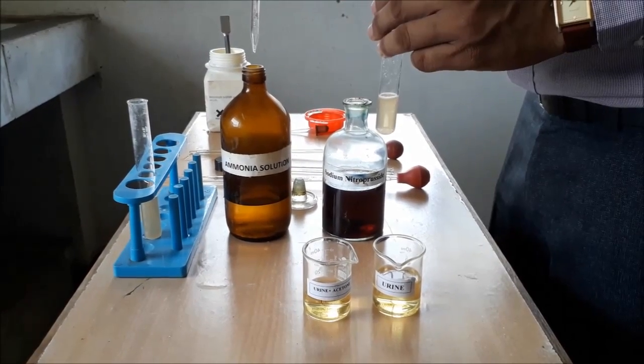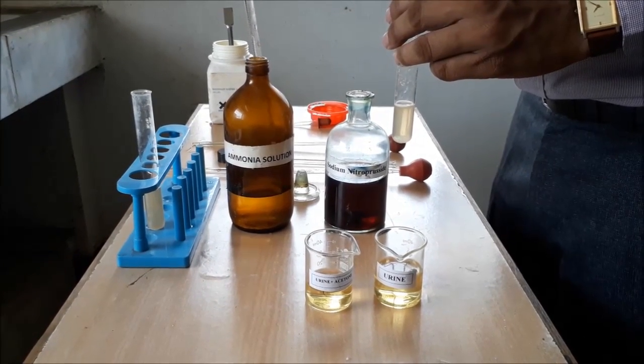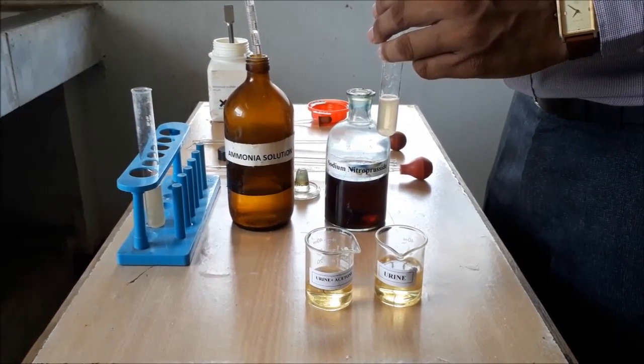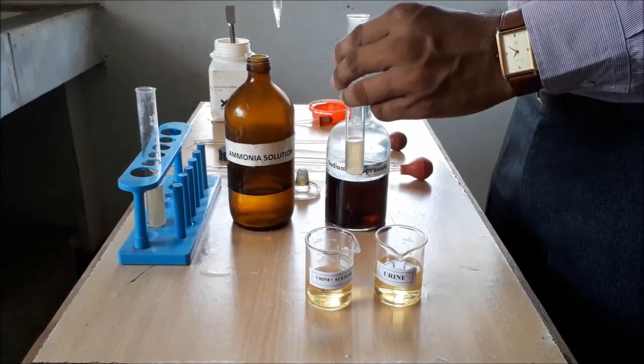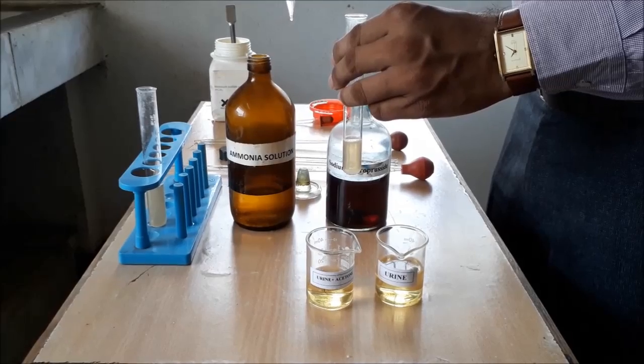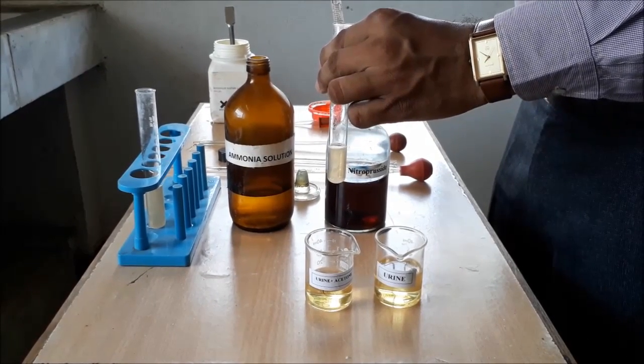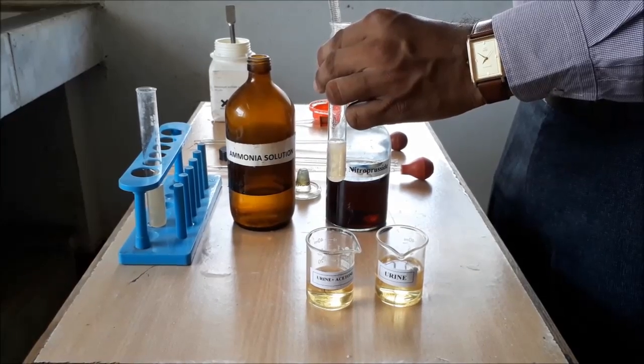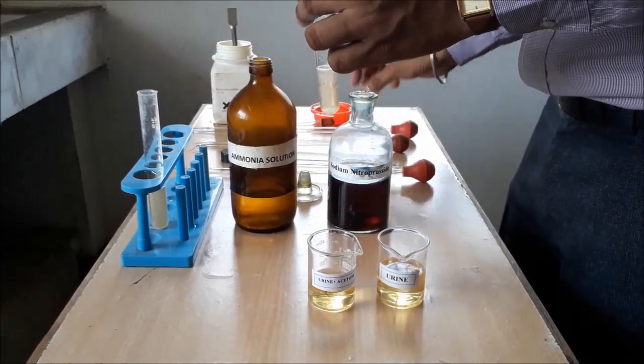And again, 2 ml of strong ammonia solution in the test tube. The strong ammonia solution should be poured through the wall of test tube.